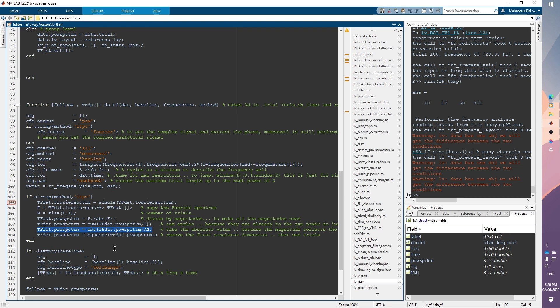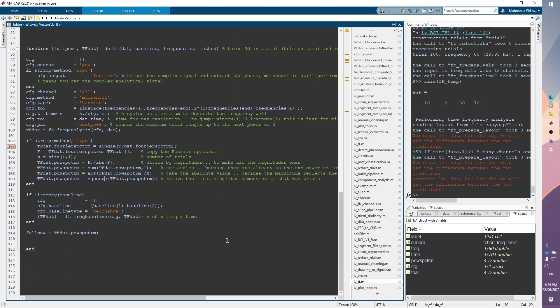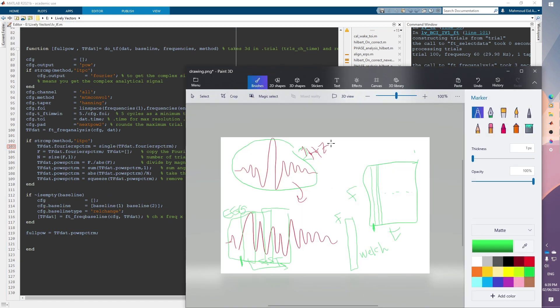The magnitude of the average vector will reflect the phase coherence, and we'll see why with some examples using real data — this is actually very intuitive. After getting rid of the singleton dimension and returning the final result, the output has the same dimensionality as the time-frequency plot, except the color bar now shows inter-trial phase consistency instead of power.